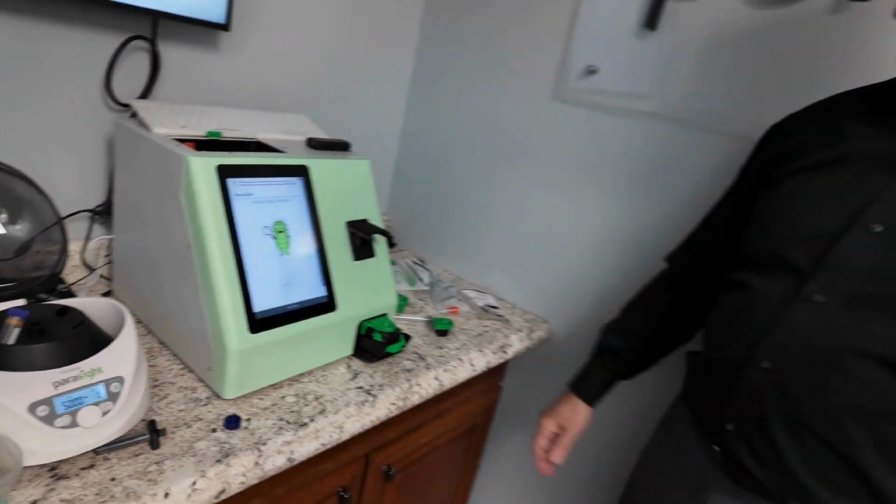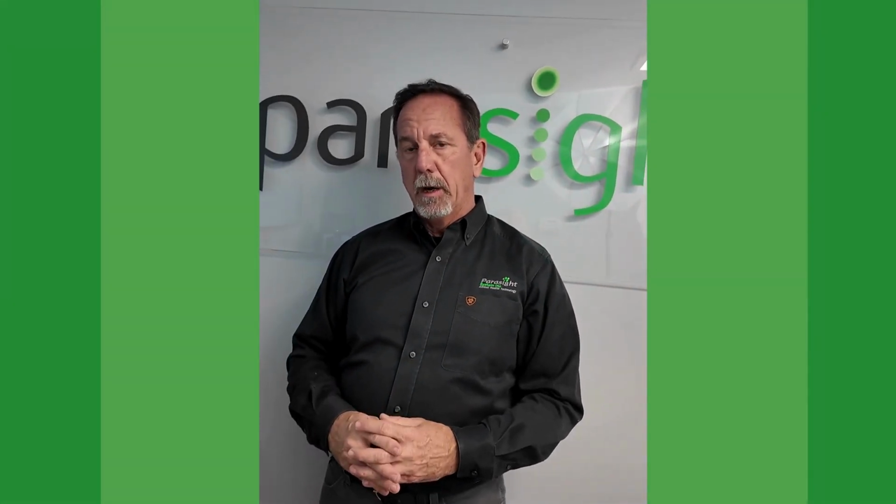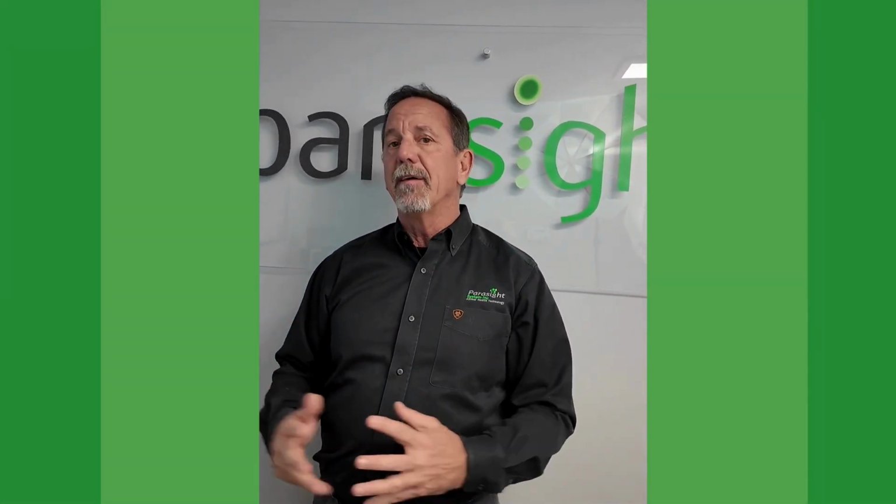And you'll now see that the test will run itself, and your result will report itself in less than 3.5 minutes from now.